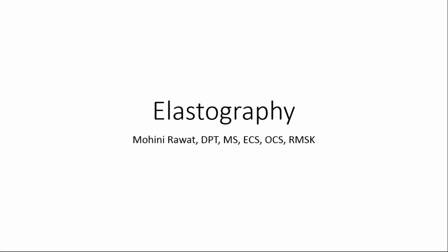The webinar. Today I'll be covering two main topics. One is elastography, and the other one is a technique that you can use to image superficial structures. So let's start with elastography.